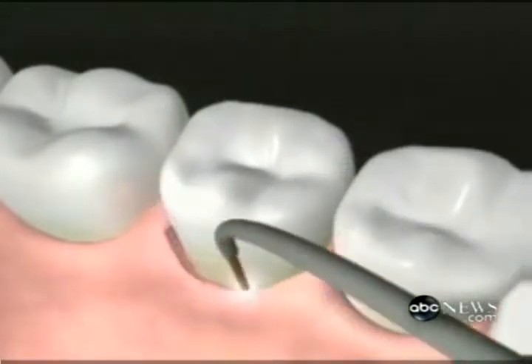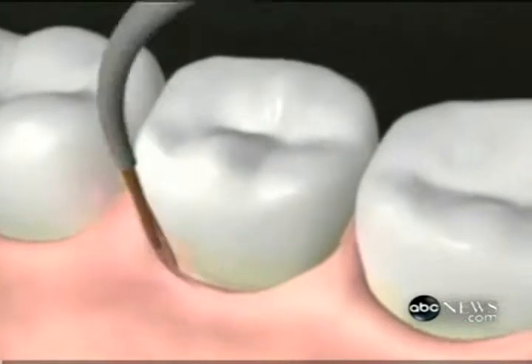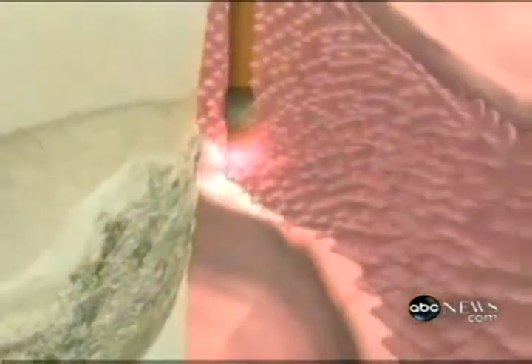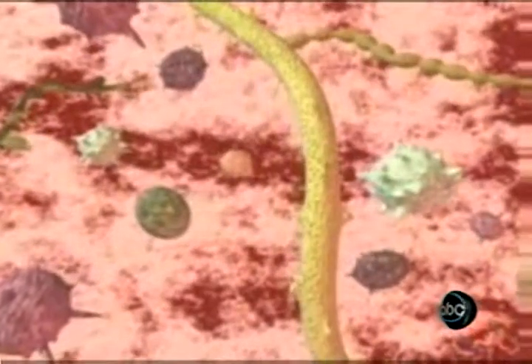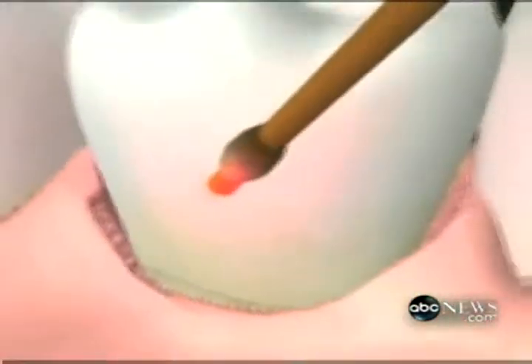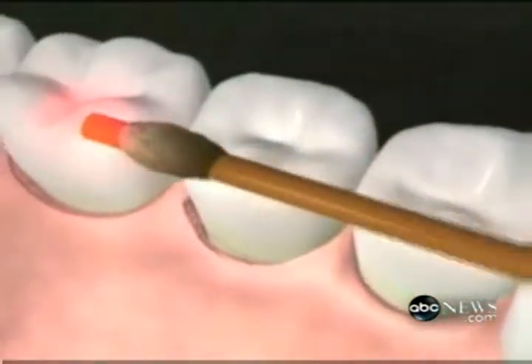structures in place. We use ultrasonic root debridement, root cleaning devices to clean the root surface, and then we use another setting on the laser to clot the blood so that we get a seal, so we don't have to use sutures. About half of the mouth is treated at a given point in time, and then 1 week later the other half is treated. Two-hour visits.